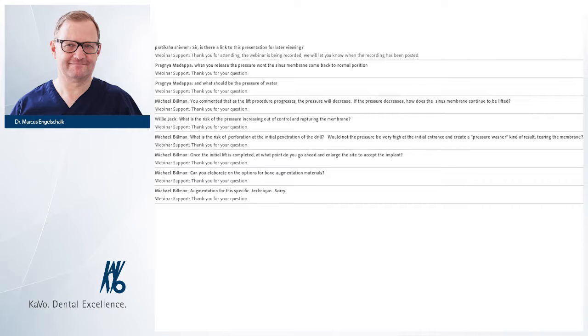Well, if you create the first burr chamber in the bone and you bring in the liquid and you're creating a pressure, you see that the pressure, that's the blue curve, will increase. And then, because the chamber is full now, the pressure stays stable. And then if you burr forward to the sinus and open it a little bit, the pressure will disappear completely, and this is why the curve will go down, because the liquid will now go underneath the membrane. There will be no pressure anymore.